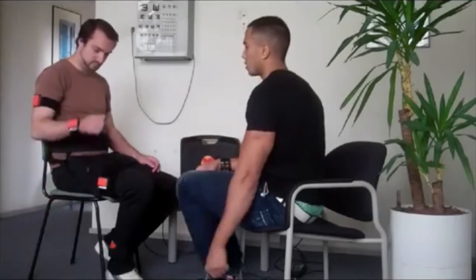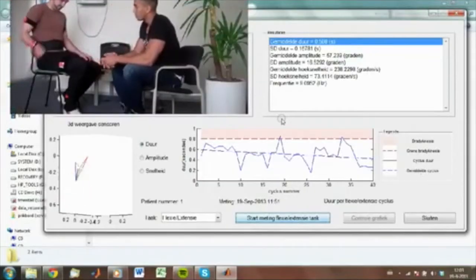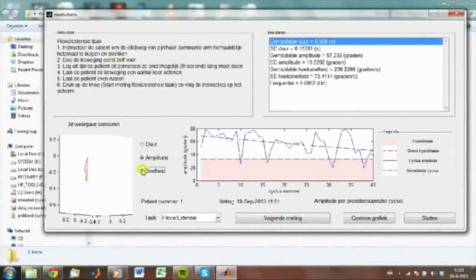The next task is flexion extension of the elbow. The patient is asked to do it as fast as possible with a large amplitude. You can see it on the monitor — the movement, first the duration, then the amplitude and then the speed.